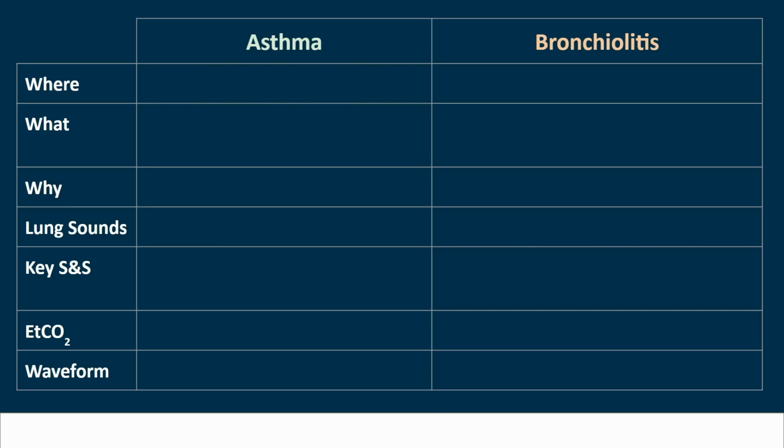And if you then give them a bronchodilator, it'll probably go up, because it's just going to come out in spades. But if it doesn't get fixed, well, then sure, they all end in zero eventually.